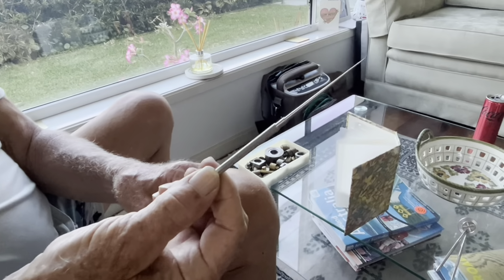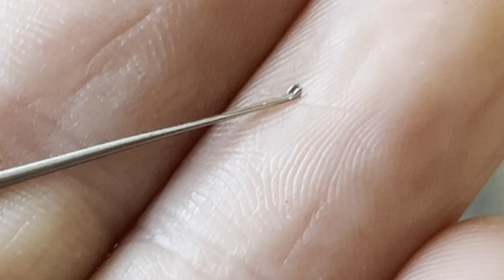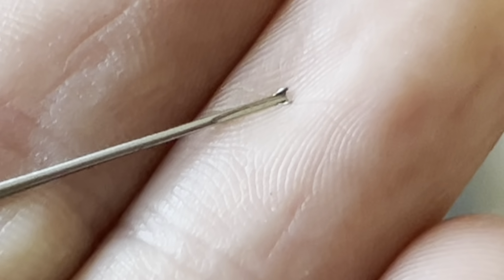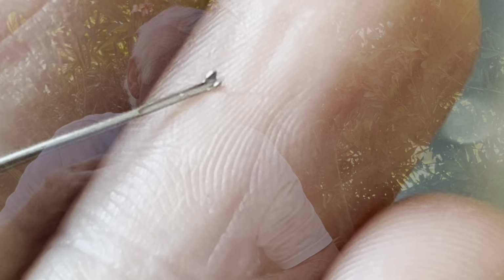They had another tool I made a few of. It was like a long, very, very thin tool. It was very long and thin. That went inside the cochlea, and they had a little U-shaped claw on the end of it that I machined out of solid steel, a special grade of stainless steel, and they used that to poke the implant electrodes in through the cochlea. So I made those for years.